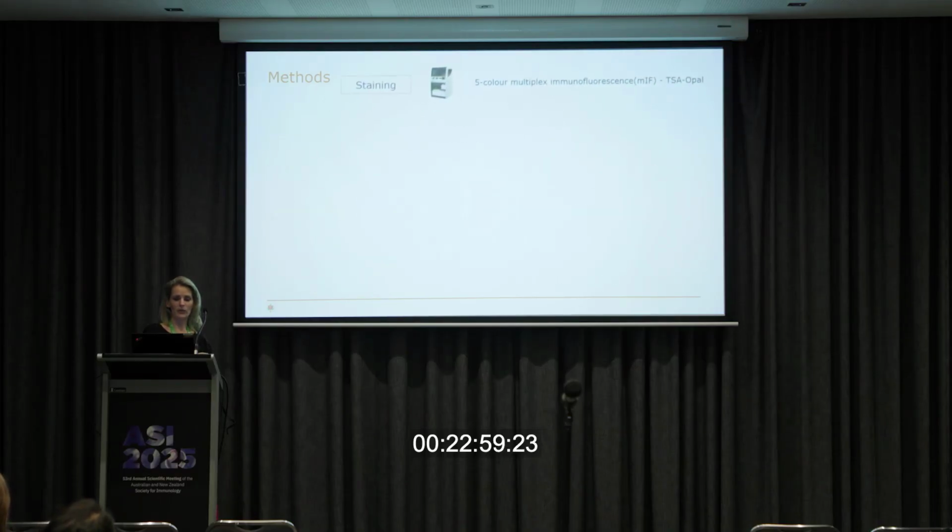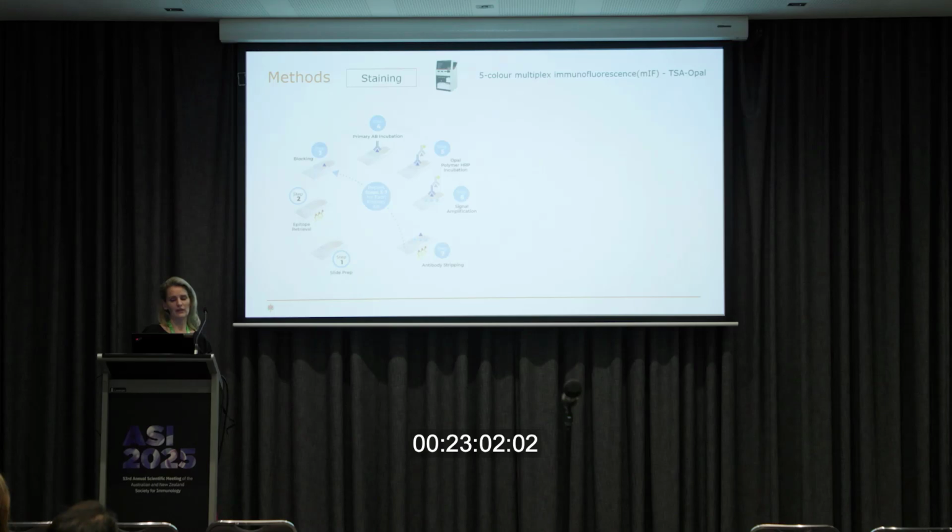This staining workup was on the Bond RX system, so I can say Ryan was quite happy he got this working. The system actually enabled us to get more reproducibility as well. We had a little bit less variation, but you might notice that previous TMA was a bit smaller than TMAs can sometimes be. We found we could get an edge effect with these kinds of systems where you have the solution flowing through. So we kept the TMAs a bit smaller and asymmetric to help us identify and orient them, and to reduce that.